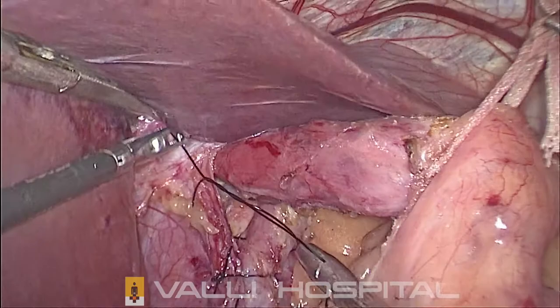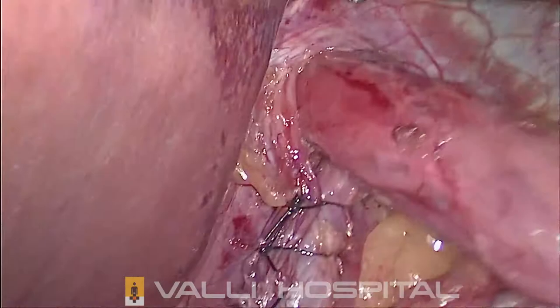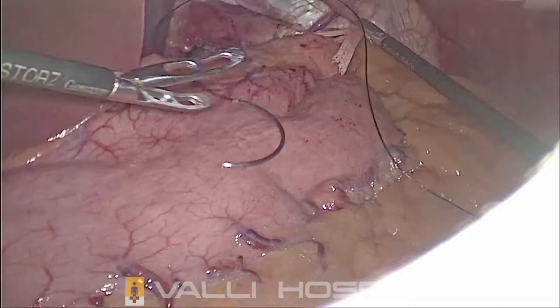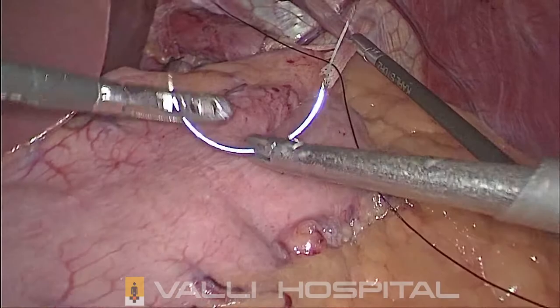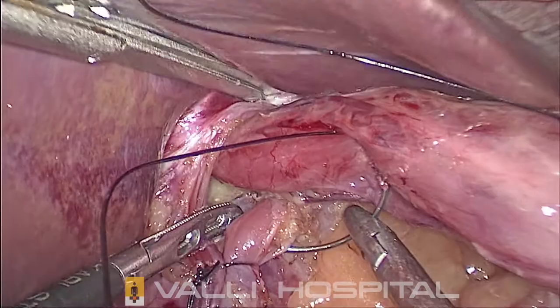You might need 2 or 3 stitches only, mostly. If the hiatus is very wide, you need 4 stitches. After putting them, you just see whether it is enough or not. This is a little more than 1.5 cm, so I want to put another stitch very close. This time you need not go 1.5 cm above, because you want to narrow down a little only. So take the bite closer, take the needle out.